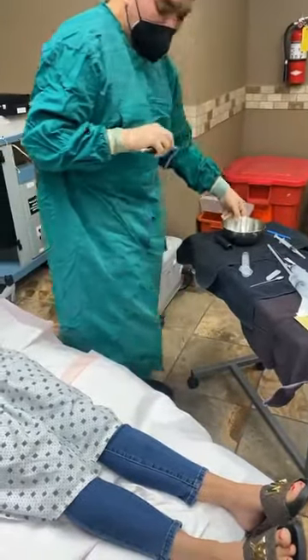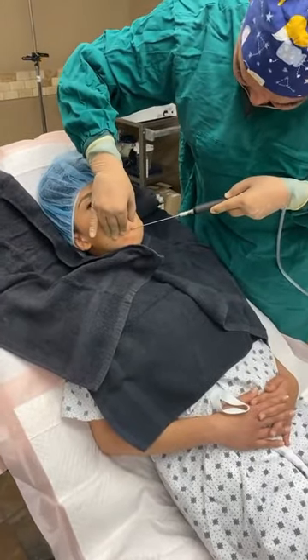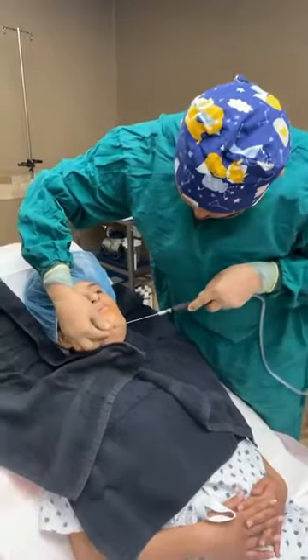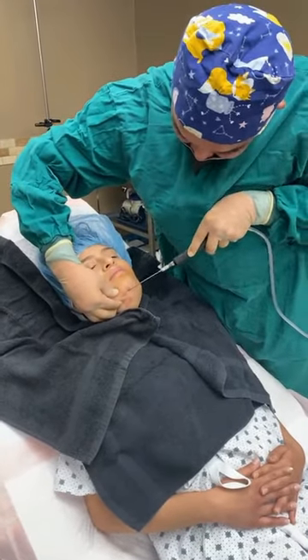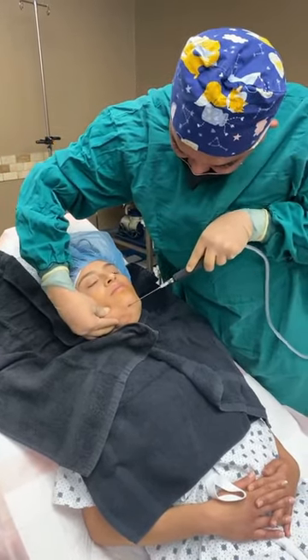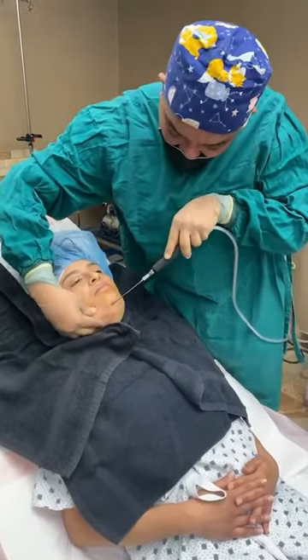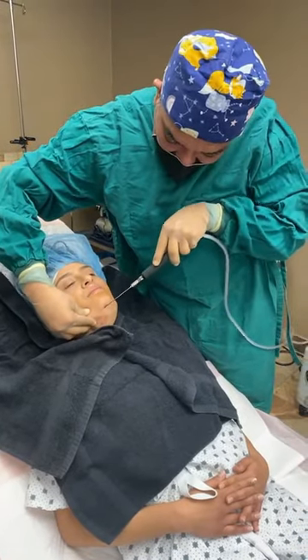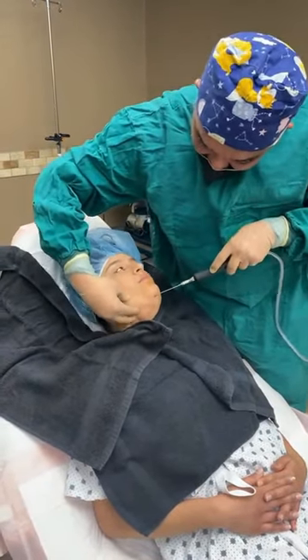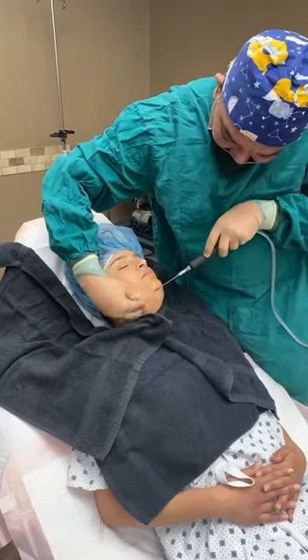Next, we're going to work on one side, so I'm going to work this way. The cannula is this big. It has four ports. I'm just going to run it into the tissue, and I'm developing her jawline, the characteristics of her jawline. However, not going up too far, I'm below the jawline, because you don't want to distort the actual cheeks that she has. Now again, this can be done by hand cannula with suction. I prefer to use the suction device.